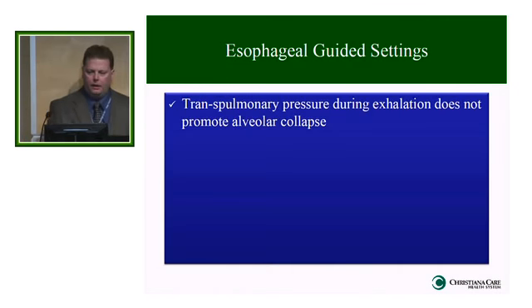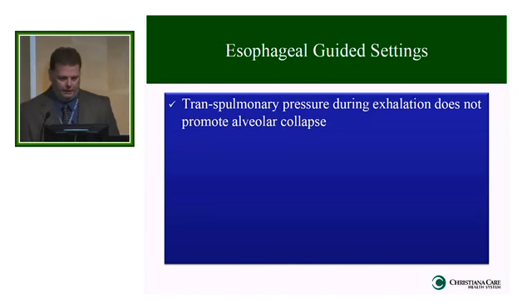In the interest of time, I'm not going to hit esophageal guided settings. This is a whole lecture in and of itself. But just to say that you can use the esophageal catheter to help you not over distend, but also to set proper PEEP levels to protect or to recruit the lung and that kind of thing.